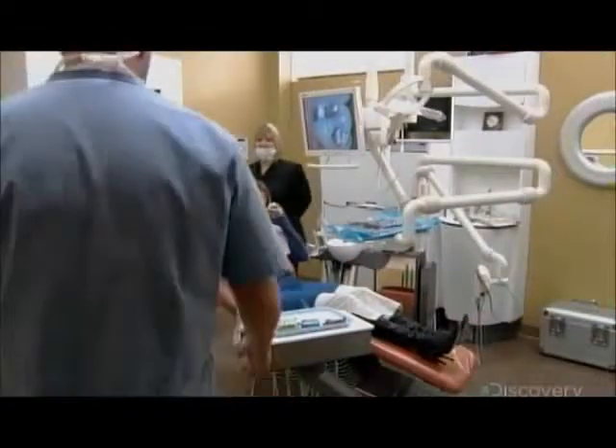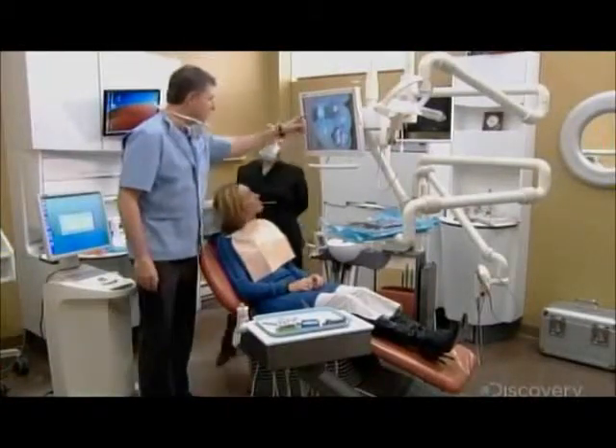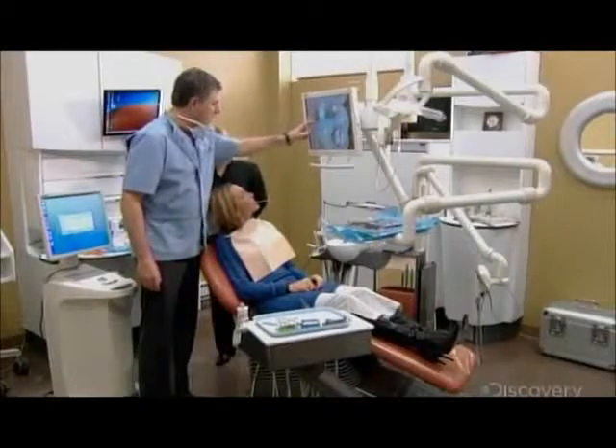The dentist meets the patient and reviews her case. They agree to replace the silver filling with a ceramic inlay, which will strengthen the tooth for much longer than a regular filling.